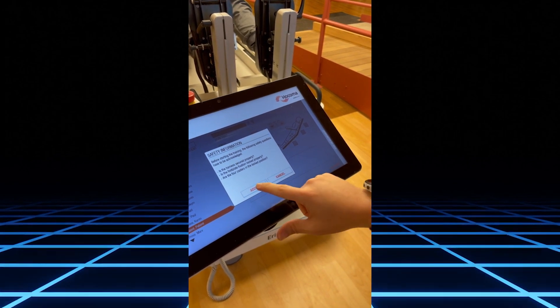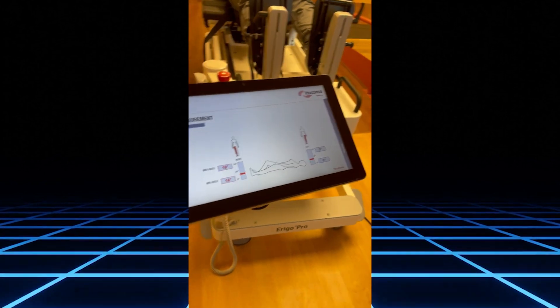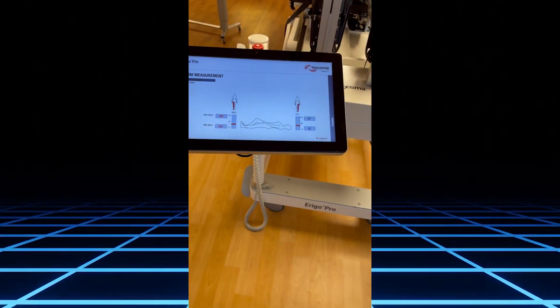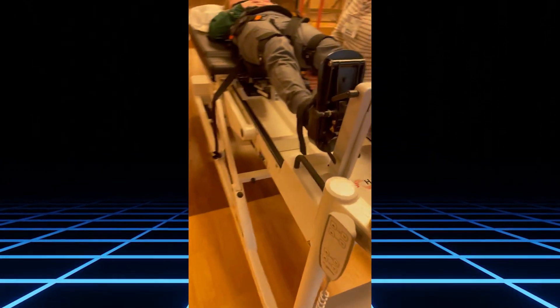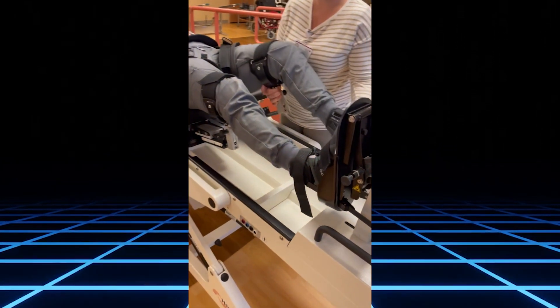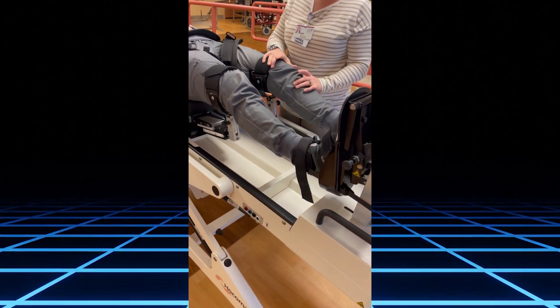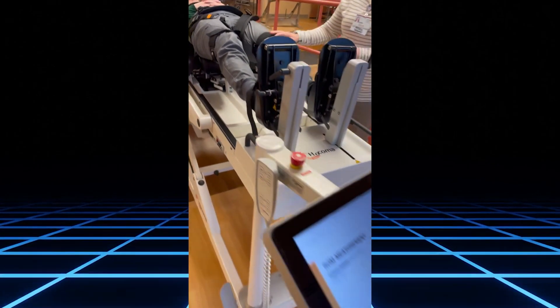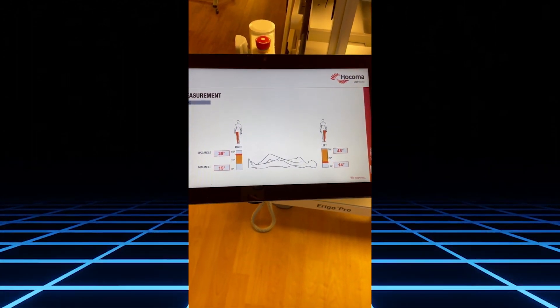Accept if all those things are correct. For range of motion measurement, you come to each leg one at a time and move the patient's legs through the range of motion — all the way up, all the way down — with gentle range of motion into knee extension. Then do the same thing for the right leg: all the way up, all the way down.